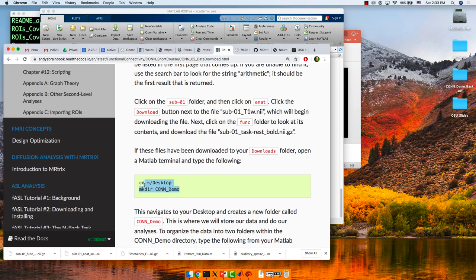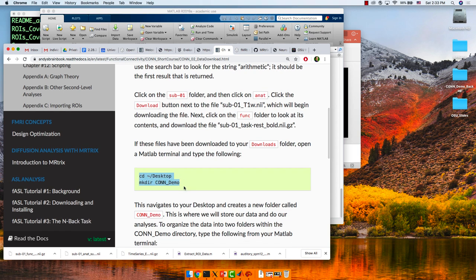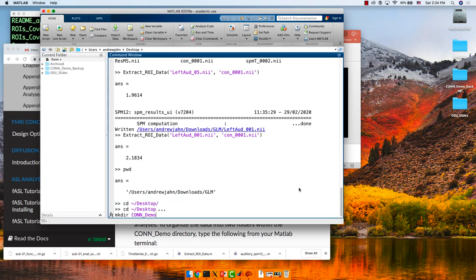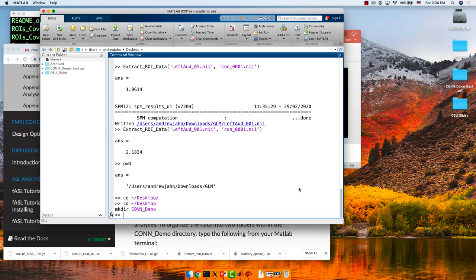In MATLAB, type 'cd Desktop' and then 'mkdir ConDemo'. Copy and paste that into your MATLAB terminal to create a new folder called ConDemo. If you can see your desktop, you should see a new folder called ConDemo has been created — that's where all our data is going to be located.